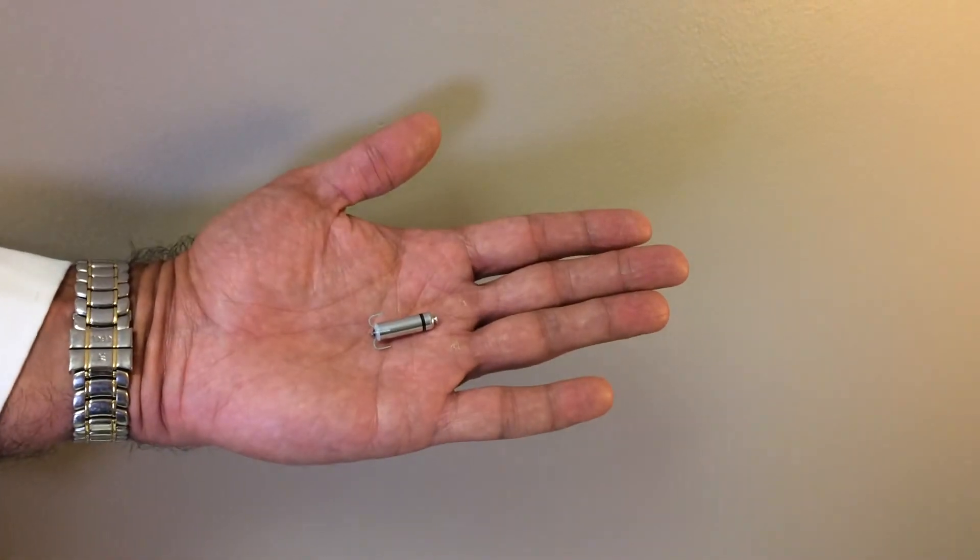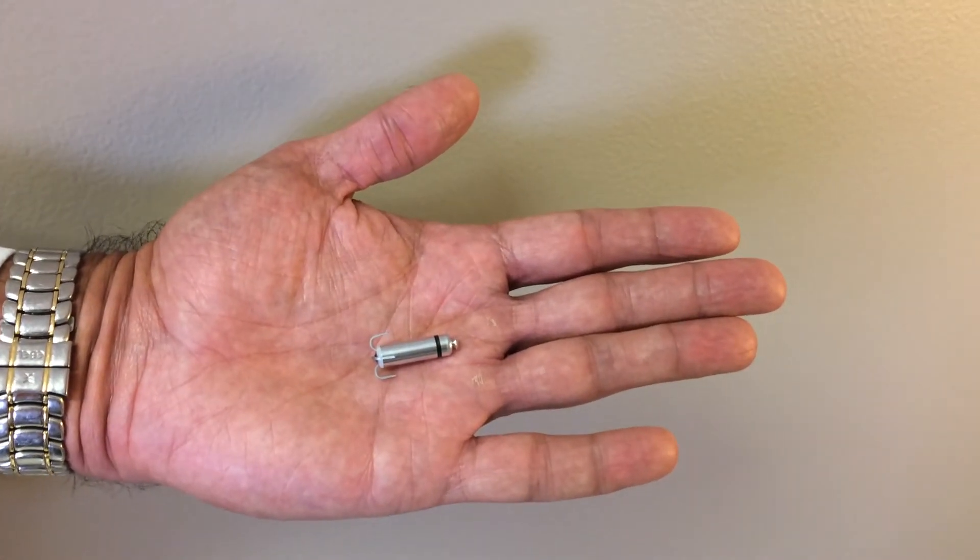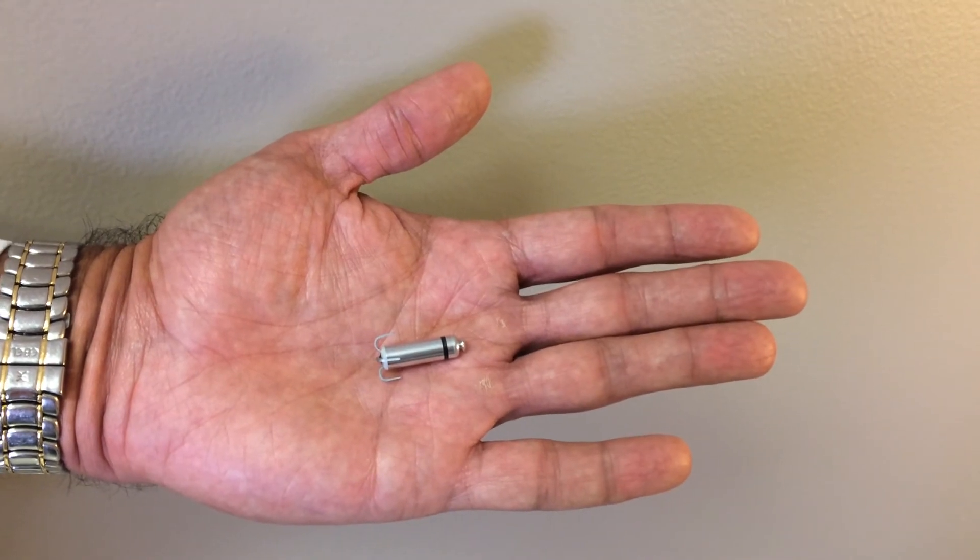It's definitely less invasive, so we don't have any risk of damage to the lung, which is a small possibility with the traditional pacemaker system. Because of less hardware, there's less infection risk, and because we don't implant and leave anything in the body in the top portion, they don't have arm restrictions — which can be all the way up to six weeks after a procedure where they cannot move or are restricted in terms of arm movement.